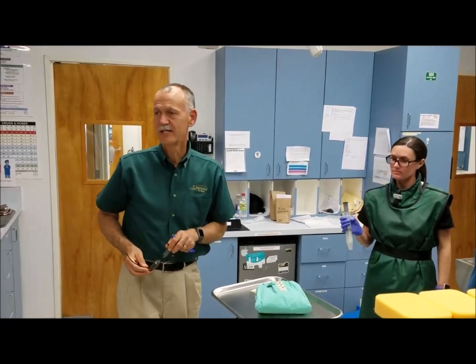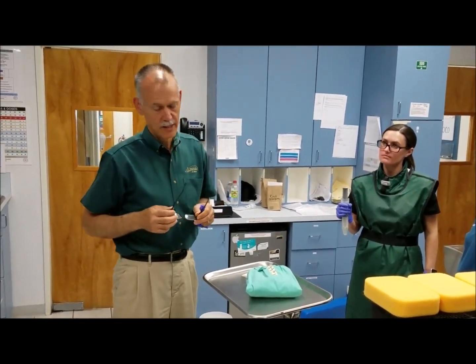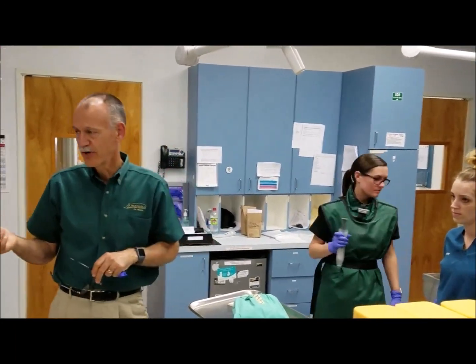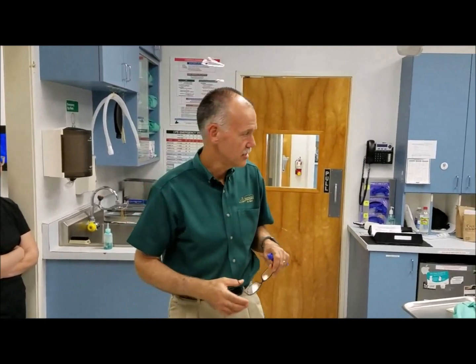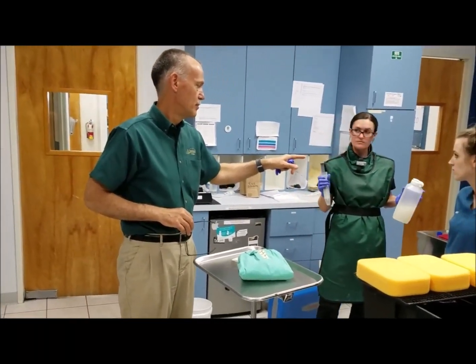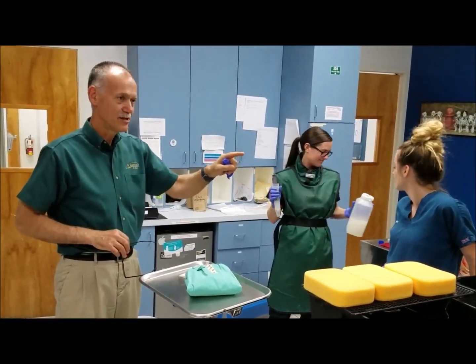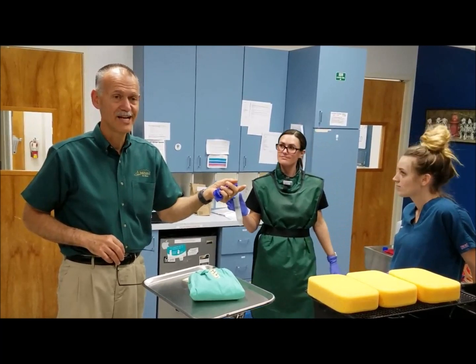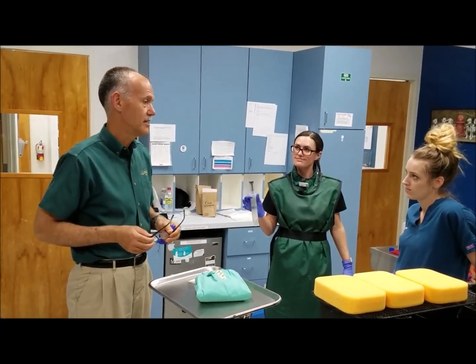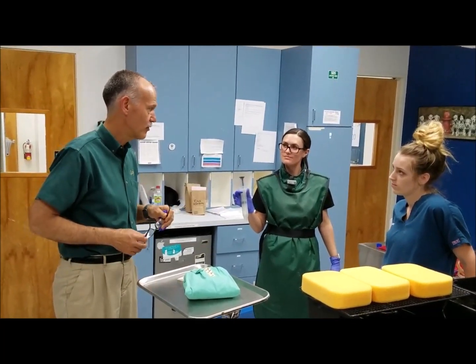I'd like to know his weight because if we need to use rescue drugs, we're going to have the math done over here. The way that we're going to anesthetize him is we have a concentrated solution of fish anesthesia. Based on my research, we're going to start with 30 mils in 10 liters. We're going to give him three to five minutes. If he's not anesthetized, we're going to add 10 mils until he's anesthetized. The top end would be 100 mils in this volume. I'm sure he'll be asleep before we get to that.